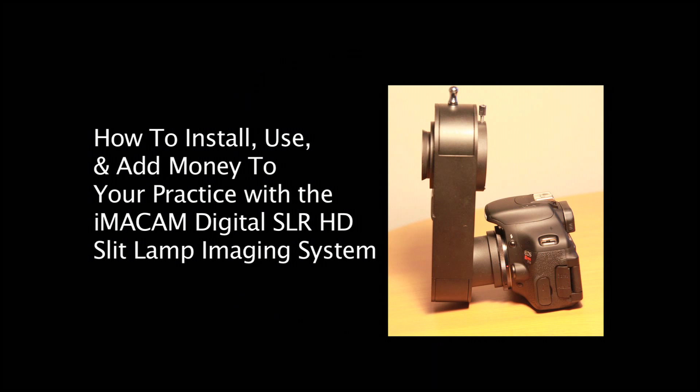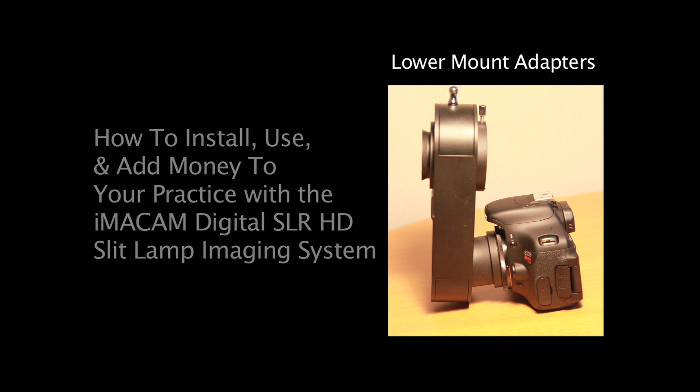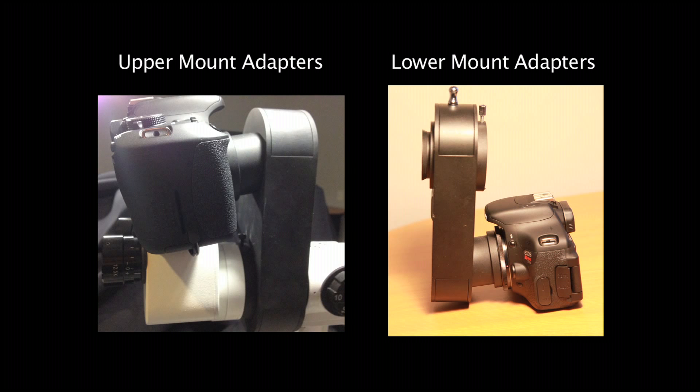This video is how to install and use the iMacam Digital SLR slit lamp imaging system. The unit comes pre-assembled and with only one wire connection for our lower mount adapter and two wire connections for our upper mount adapters. This depends on which slit lamp you're adapting.